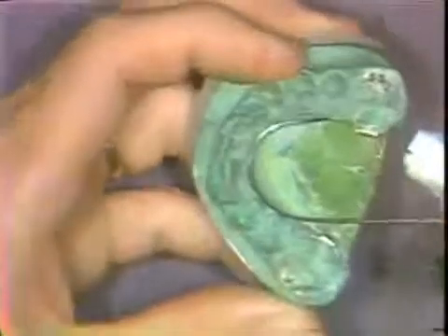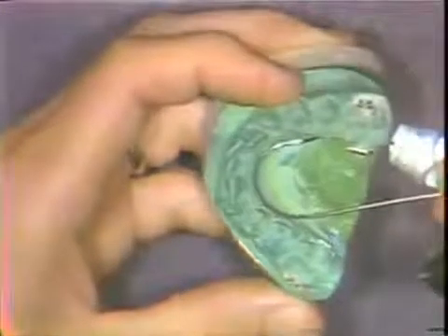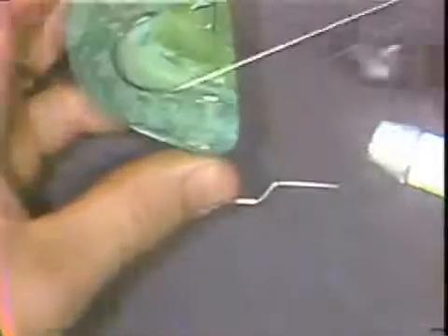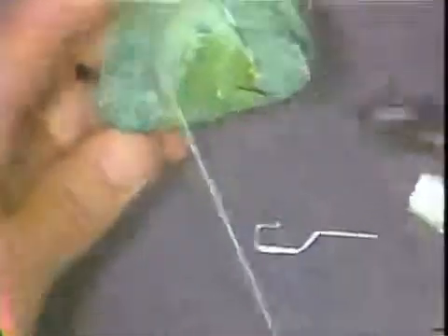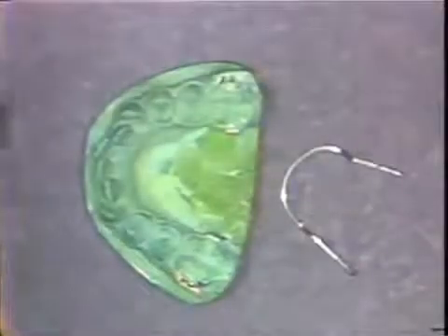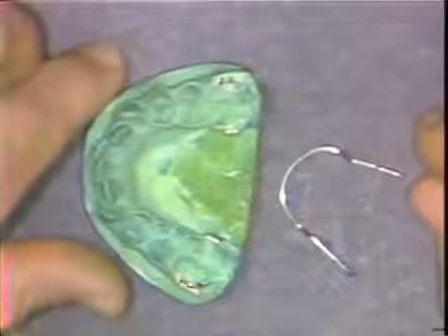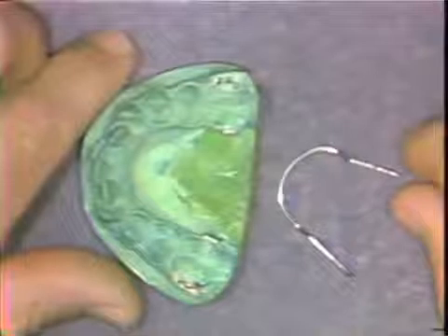It is slid into place. At this time, the wire configuration of the anterior portion is completed, and the steps are reversed for the left side of the lingual arch. The final steps in the placement of the lingual arch is, of course, the insertion and tying it into place.